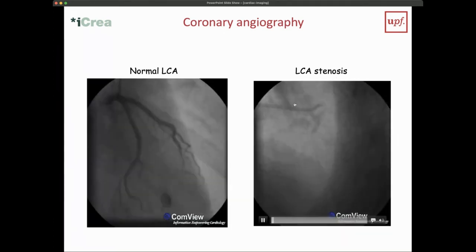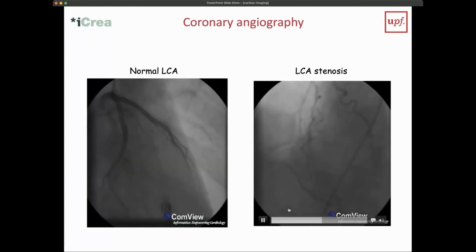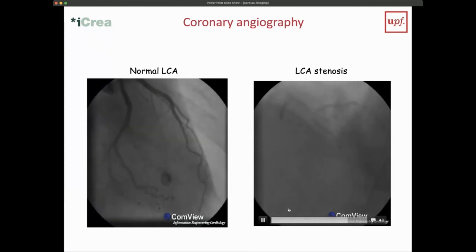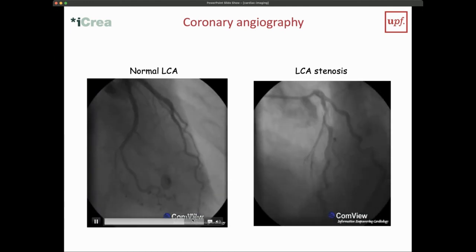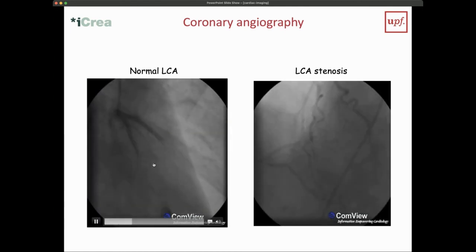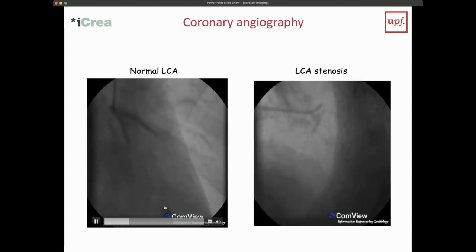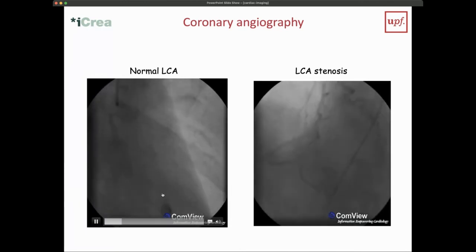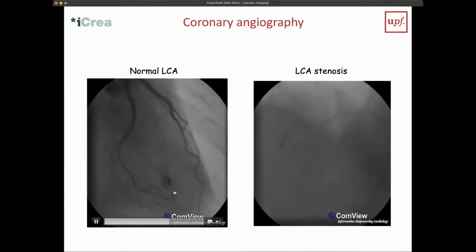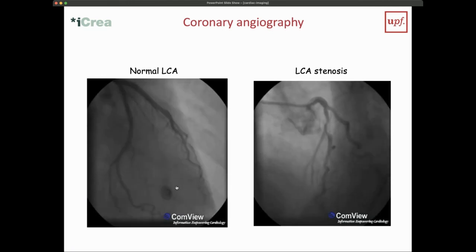You see there's no blood coming from the right side, but luckily the patient still doesn't have a full infarct because of this connection. So these kinds of things we can visualize this way. Maybe one thing which is also relevant is when you start looking here, you see this dark structure which is actually moving. It's not beating with the heart, so it's not connected to the heart, but it's moving when we apparently are moving the tube.